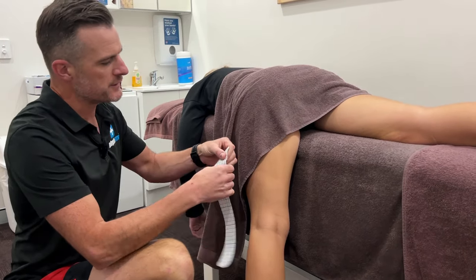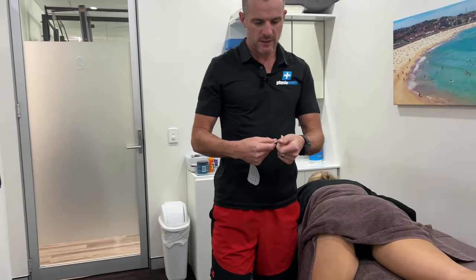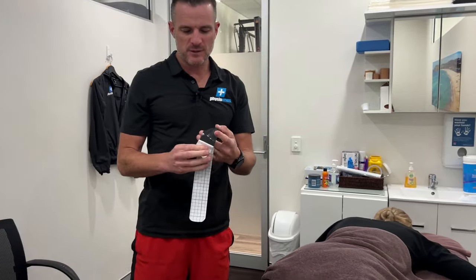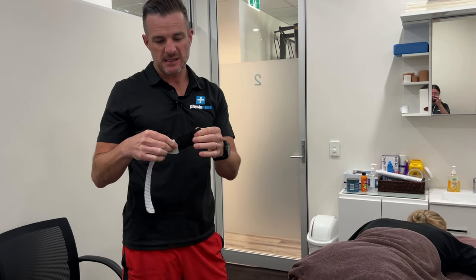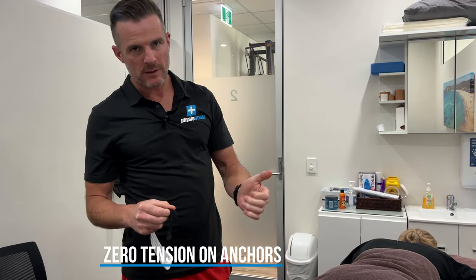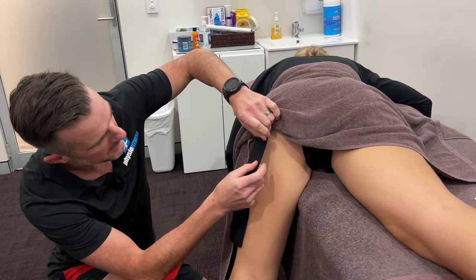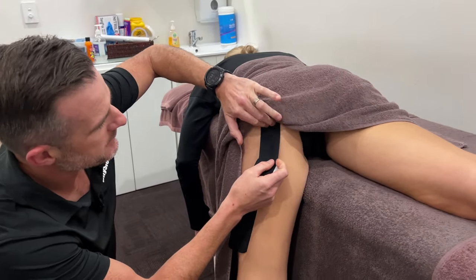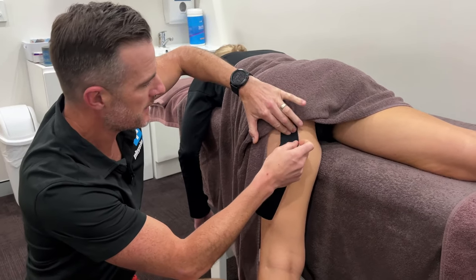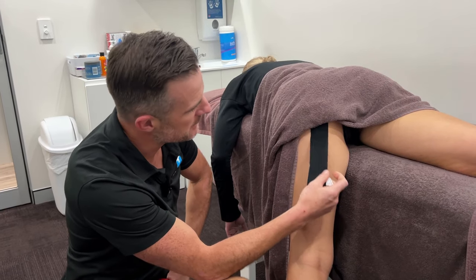What you want to aim for is doing the origin first. Think of where the top of the hamstring is — you want to go sort of above that ischial tuberosity. Remember the attachment point — about two to three inches — is going to be no tension, because you don't want tension on that anchor; when you pull it, it'll just rip it off. This thing needs to stay on for a whole game. So straight on top of that, make sure you really anchor that down, make sure it's tight and really pushed on and almost set before you go and pull on it. You can see I've got a strong anchor there.